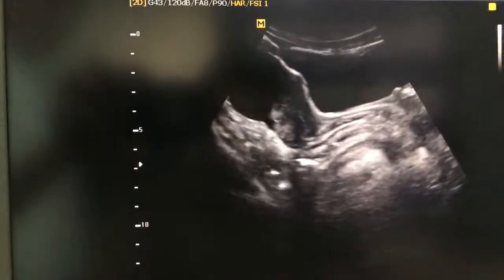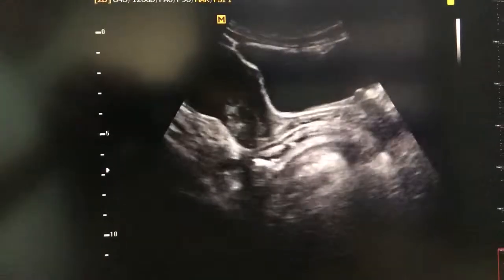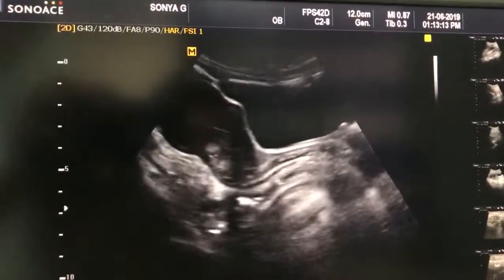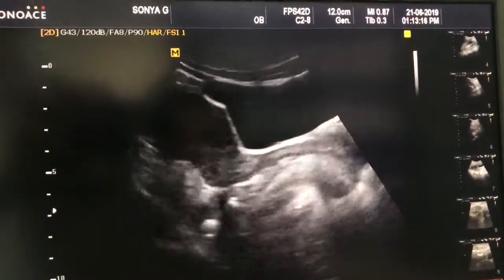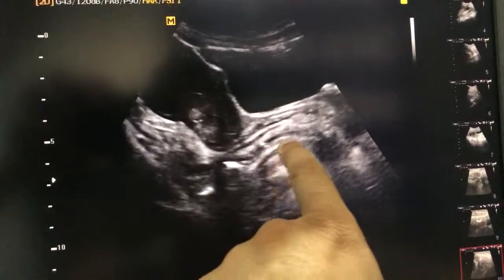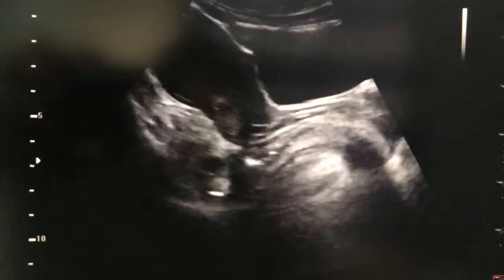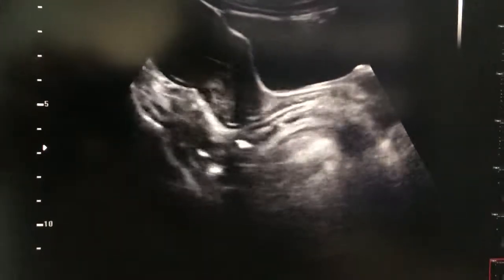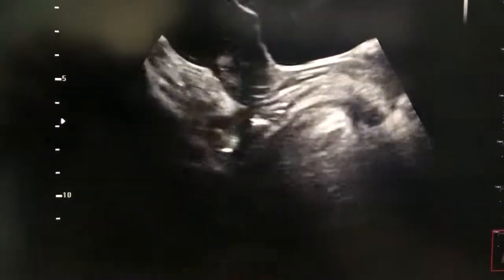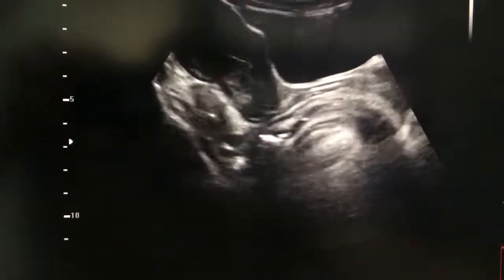And it is quite a little bit prominent, so there might be edema. That is the reason patient is having complaint of bleeding per rectum since 1-2 days. So this rectum, which we see somewhat easy to identify, it could be due to edema. A normal rectum also we can identify if the bladder is full and uterus is behind the bladder, and we can make a good window to visualize this rectum.